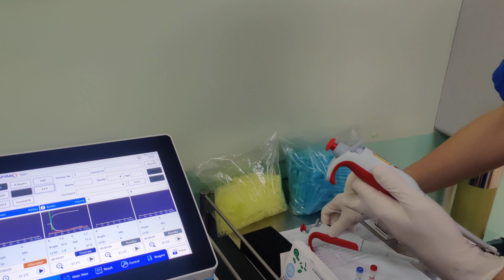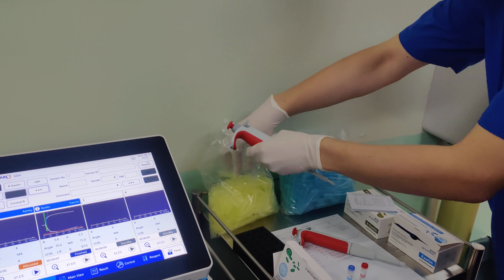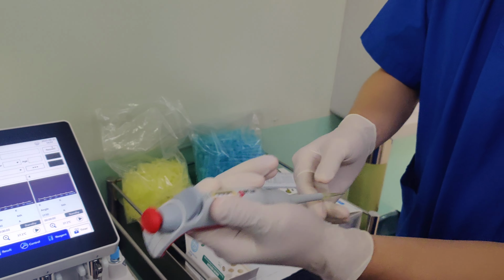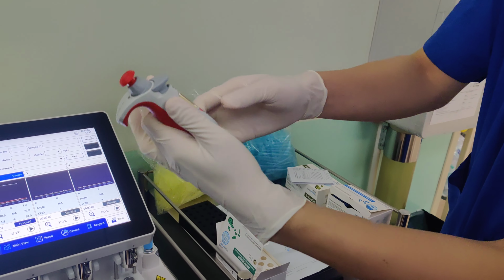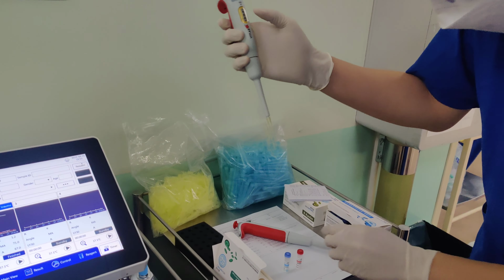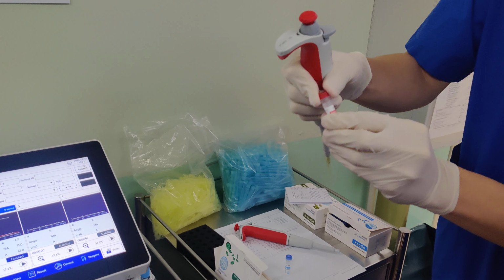Okay. Then for this pipette, we will need the pipette tips. This is where the liquid will all be inside. Okay. So how to load it? We just push it up. Okay. Make sure it's secure. 20 microliter, as mentioned here. So you get the pipette.